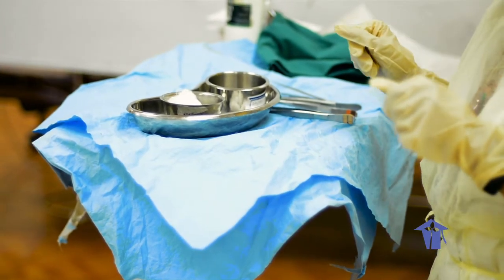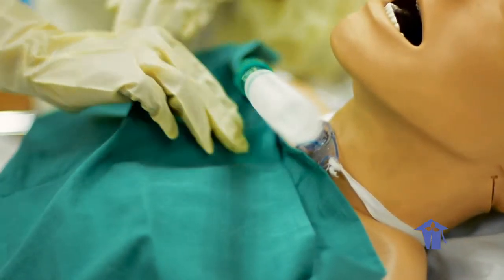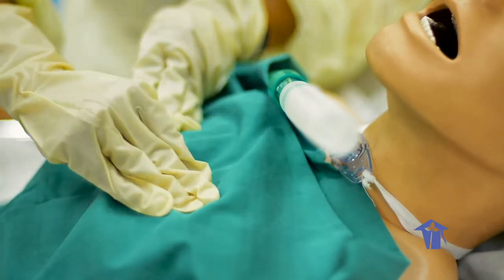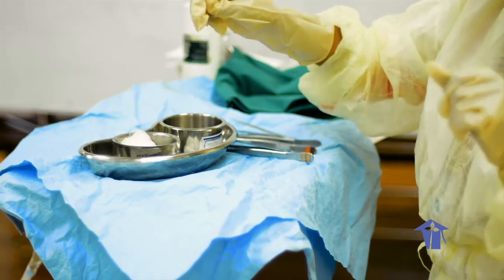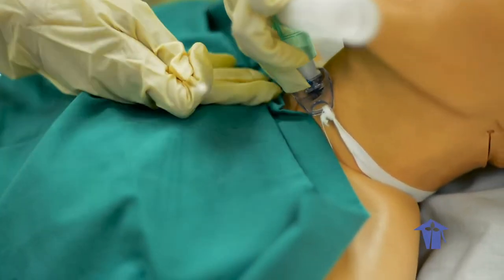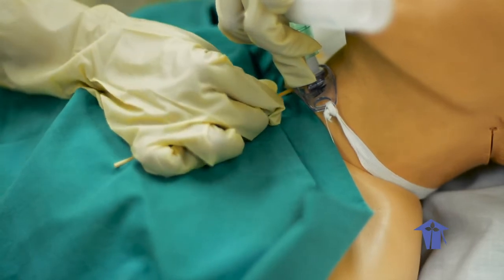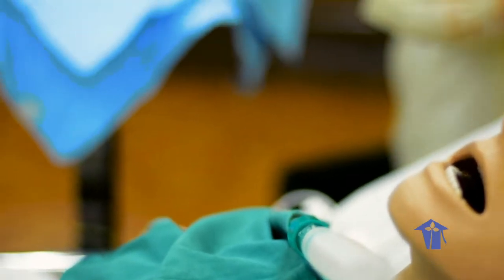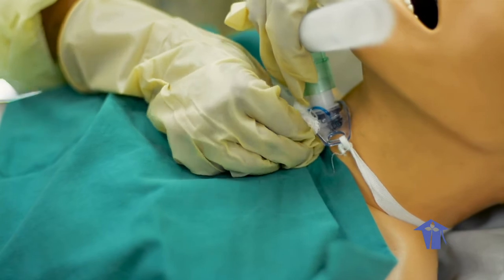We would remove our oxygen source if necessary. There's no need to remove the oxygen source. Remember, your patient's SpO2 would have been monitored at this point. It's within normal limits at 97. You would dip your cotton tip applicator or gauze sponge in a cup or basin with saline and clean the stoma under the face plate. Use each applicator or sponge only once, moving from stoma site outwards. Make sure that the skin area is dry.